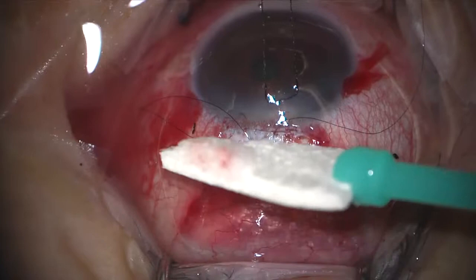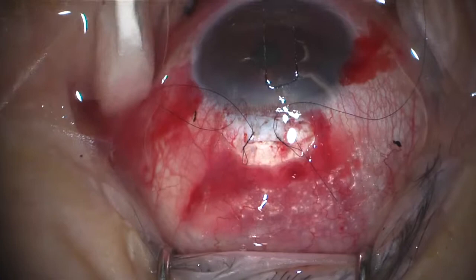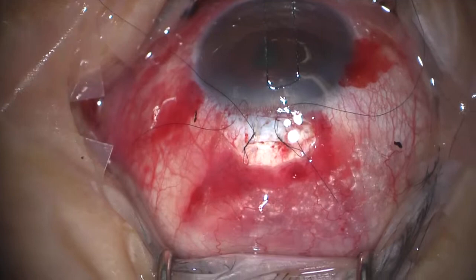And so what we'll do now is see if we can, by just burping it, pressing here, whether there's any drainage. There we are. And with very gentle pressure, it drains. So that's what we're trying to look for. A dry field, but drains with gentle pressure.